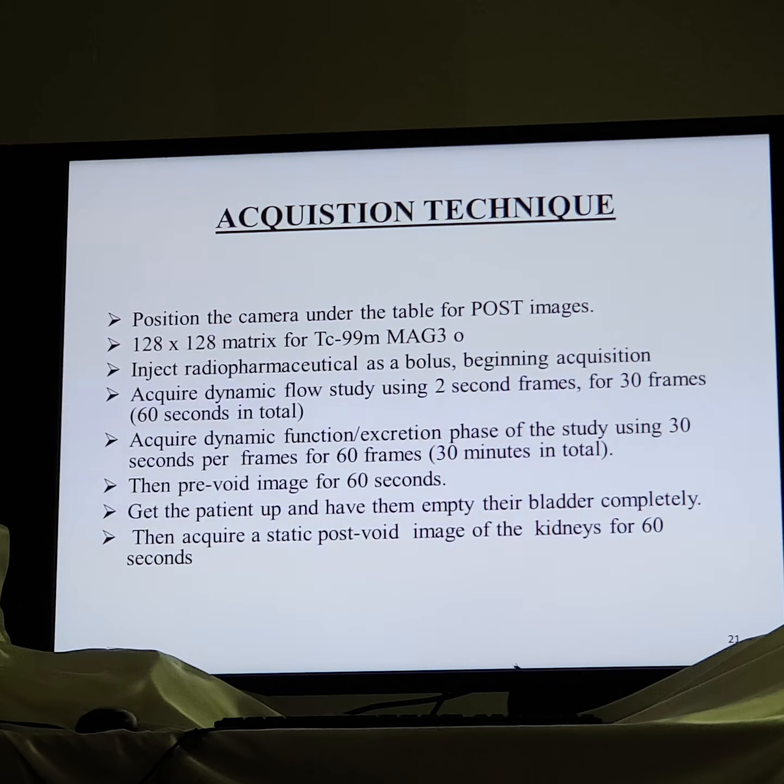Then when this function phase finishes, we start for 1 minute, what we call the pre-void image. Then we ask the patient to go to the bathroom for voiding. Then they come back, and we scan them for the post-void image.